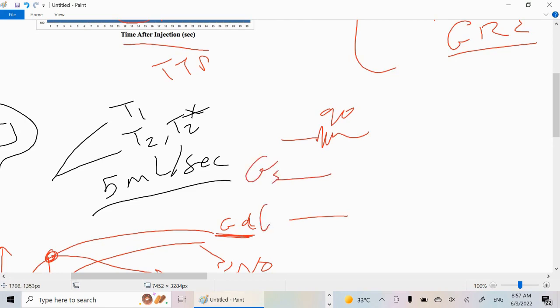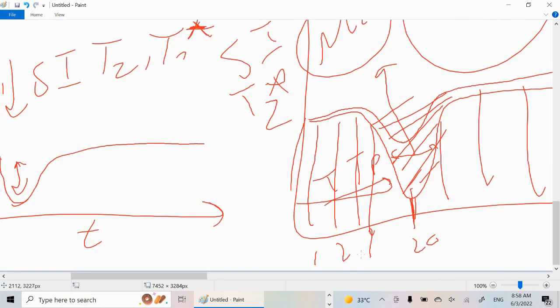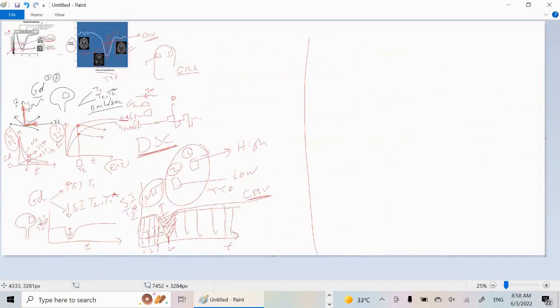The imaging process in this context is a multi-step procedure, each step being vital to the overall success of the imaging. Initially, slice selection is performed, which isolates a specific section of the subject. This is done by applying a gradient field, allowing precise targeting of a particular slice. Next, phase coding is used to encode spatial information into the signal, which is crucial for image reconstruction. This involves additional gradients that control the signal's phase. Following this, frequency coding is applied, which differentiates signals from various locations within the slice. By using a frequency gradient, signals are separated based on frequency, resulting in a clear image.